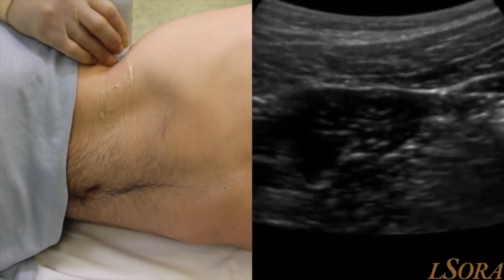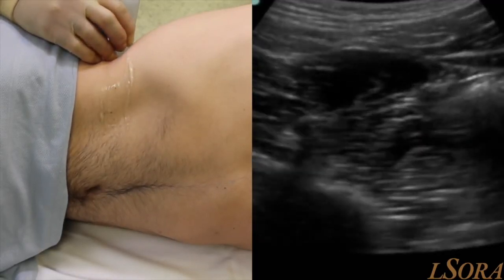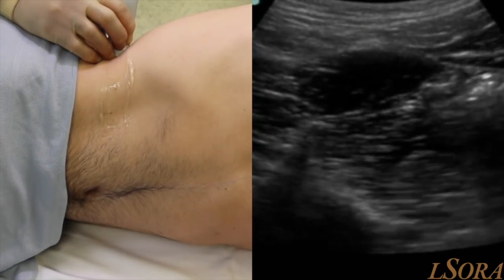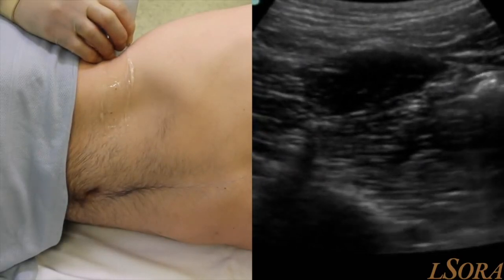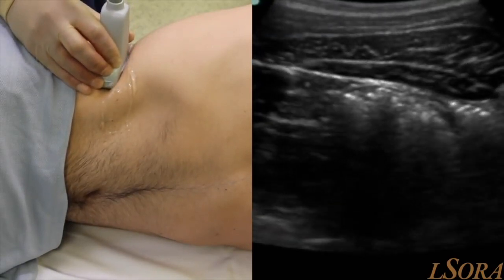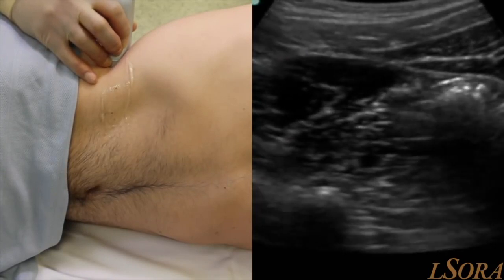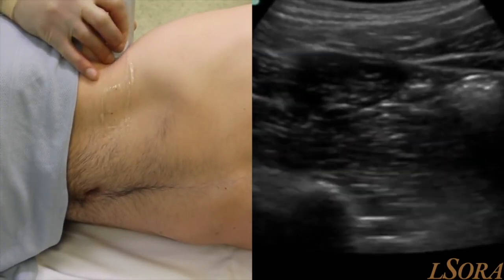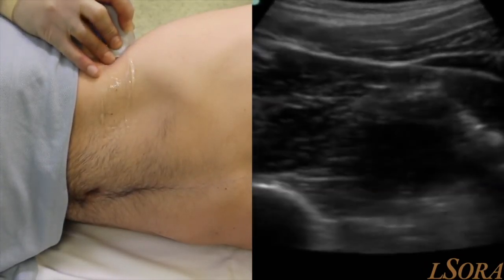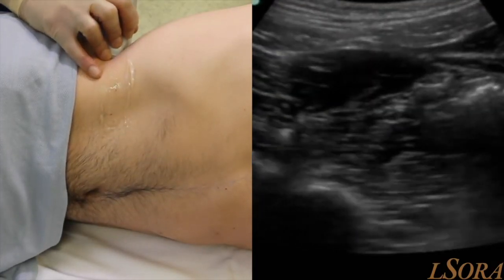We can now see the thick dark muscle of quadratus lumborum and its relationship with the transverse process and the vertebral body. If you back onto the abdominal wall to reorientate yourself, you can see the three abdominal wall muscles and their connection as they come posterior and laterally with quadratus lumborum muscle. You can also, by rocking and tilting the probe, appreciate the relationship between psoas, erector spinae and quadratus lumborum.